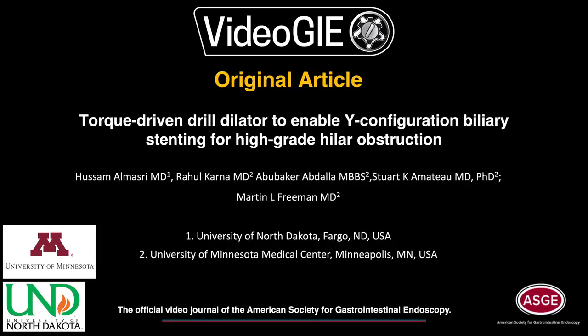Torque-driven drill dilator to enable Y-configuration biliary stenting for high-grade hilar obstruction.